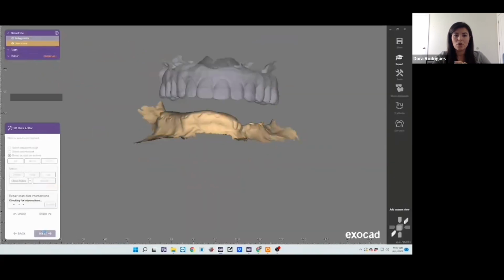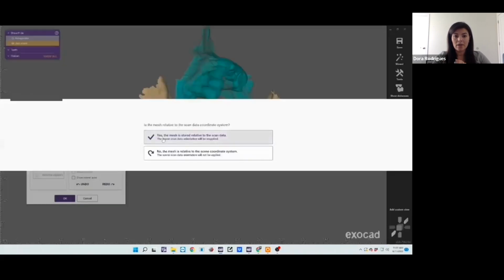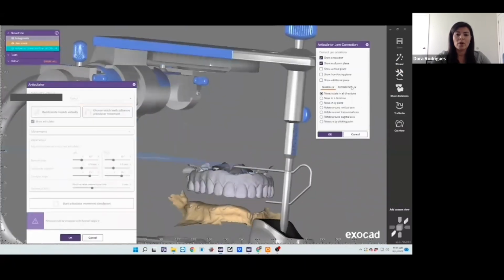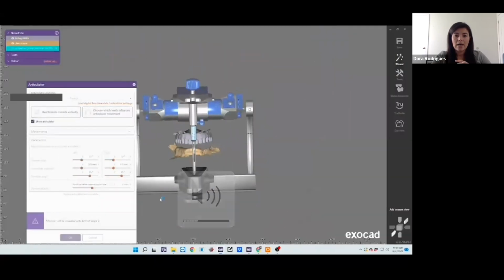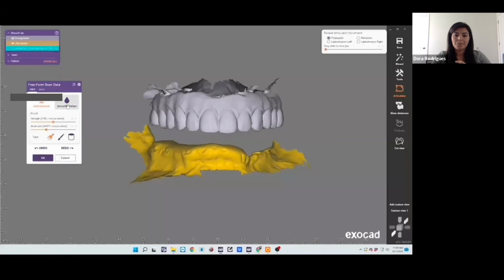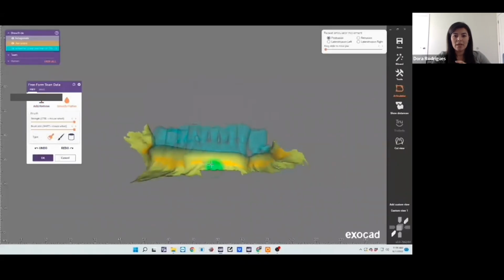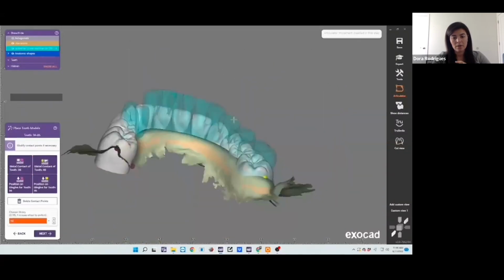design our denture. We're closing the holes, and then we need to bring our pre-op again, right? I removed the teeth, so I want to make sure that I follow more or less where the teeth were before. So I bring them into my design. I place my models, my STLs, on my articulator, and then I start smoothing the bone down to make sure that it's even all around. And then I select the teeth and start positioning.